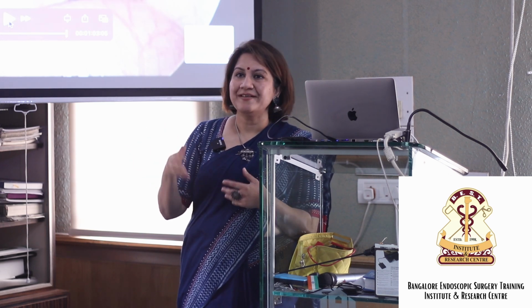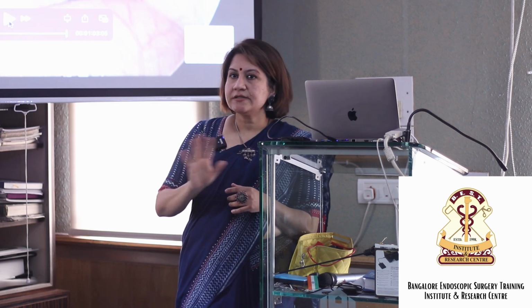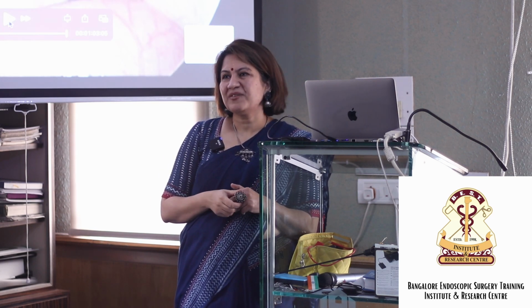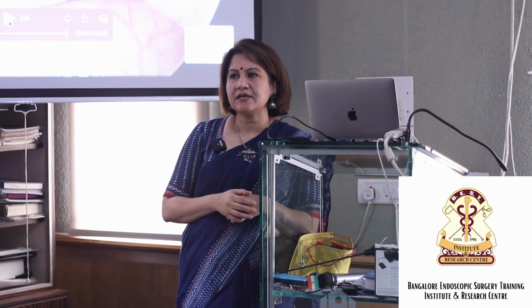Okay, we've done something. We saw the adhesion, we released it. Whenever I found that the fimbrial end is very badly adherent, we've released it, but pregnancy rates have not been good. I think the rest of the tube must also be generally damaged. No, it's not been very satisfying.